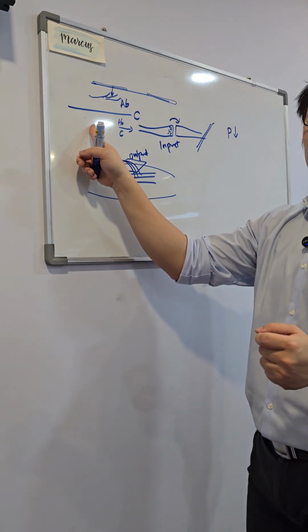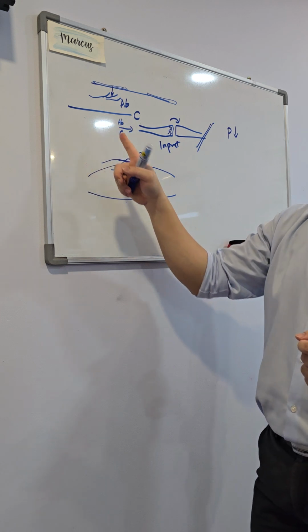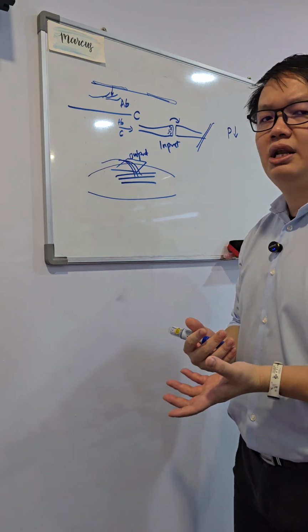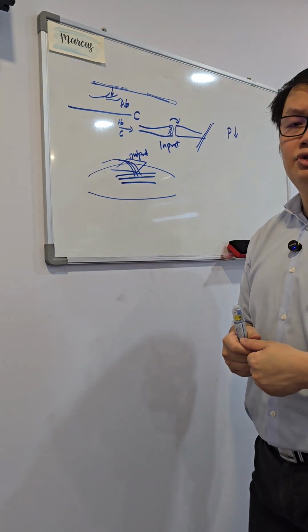So this one I tend to do for a peripheral nerve issue, whereas this one I tend to do with more of a pain presentation where they are more postural, muscular related. Now we come to interferential.